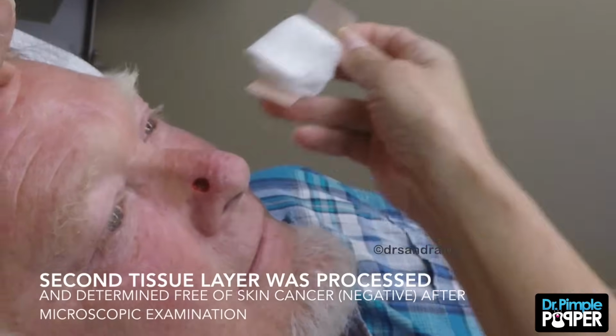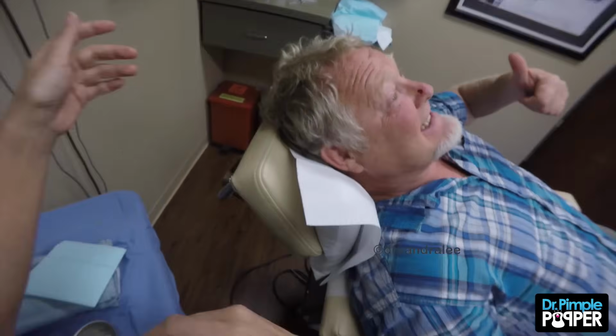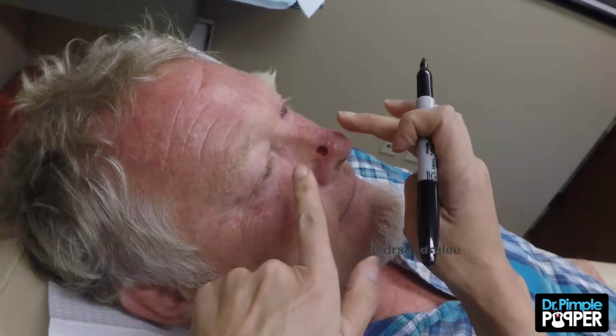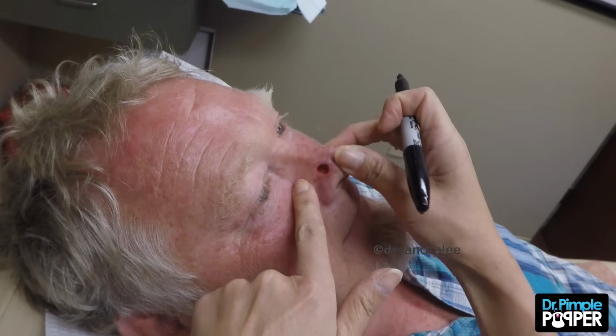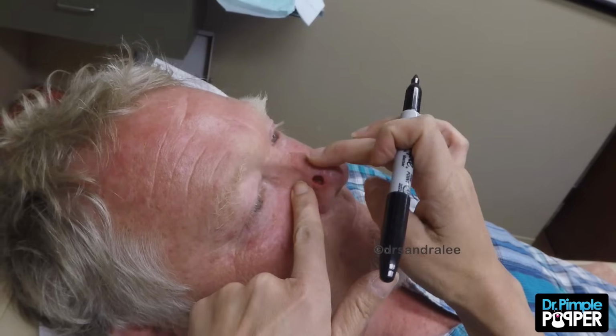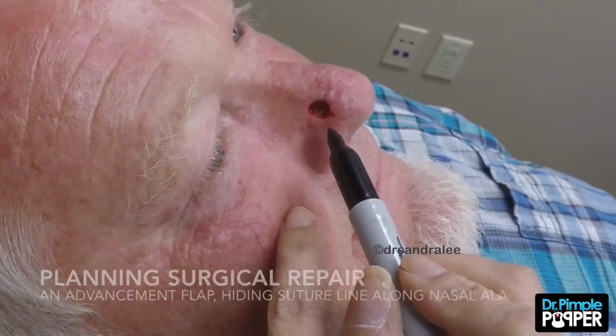Here we have our skin cancer removed completely, right? Let's try a fun one. This is the kind I like to do on the nose. It's pretty small. He's got a good nose to work with, except that it's not very movable, actually. Your nose is not very wobbly. Some people's are more wobbly than others. Did anyone ever insult you like that before? No, it's that Viking in me.